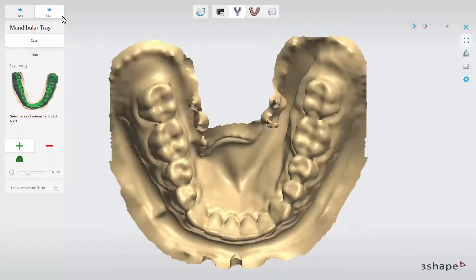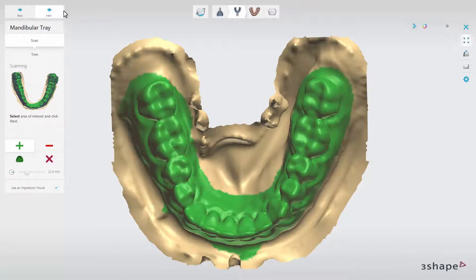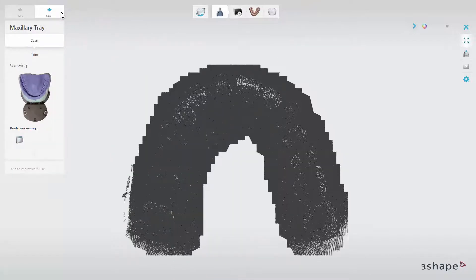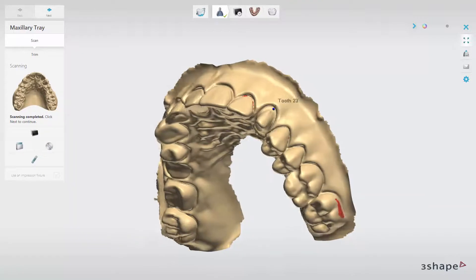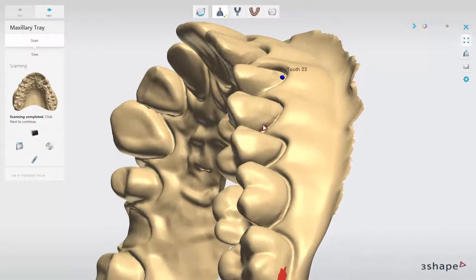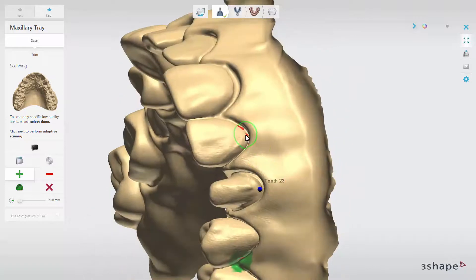The detailed scanning of the upper jaw will start. Now you can select an area of interest on the antagonist impression and click Next when you are ready. Detailed scanning of the lower jaw will start and the upper will post-process. When the scans are ready and red areas occur on crucial parts of the impression, you can enable the Adaptive Scanning option. The Adaptive Scanning option can be used for both restoration and antagonist impression scans — it will allow you to re-scan the selected areas. Just mark parts of the scan that should be re-scanned and click Next.